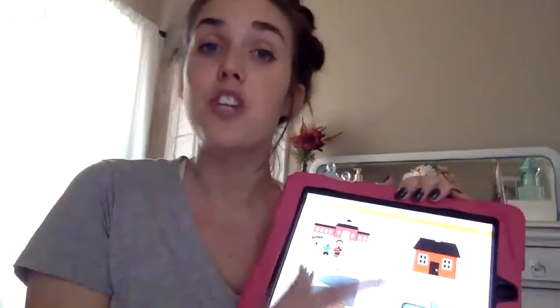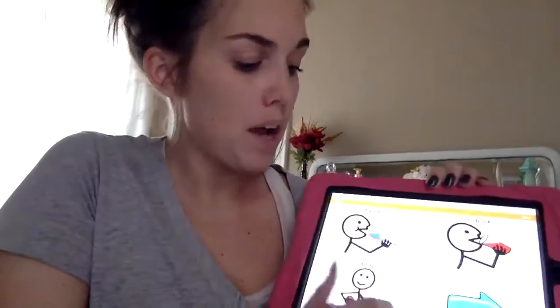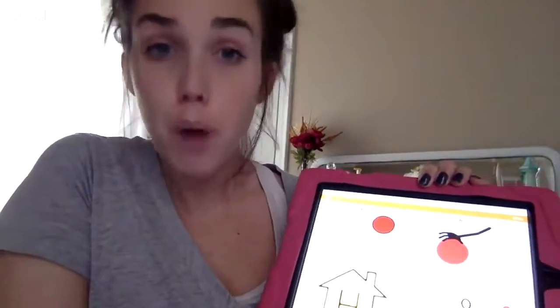They can get very specific, and we as staff members take exact pictures of those places and transfer them onto the TouchChat in that moment, which is also really beneficial because the child's wants and needs change regularly. Throughout the day, staff are able to upload and change those pictures, and it will always repeat back to the child what it is that they want. "I want to play with my ball." "Throw it." So it can get very, very specific.